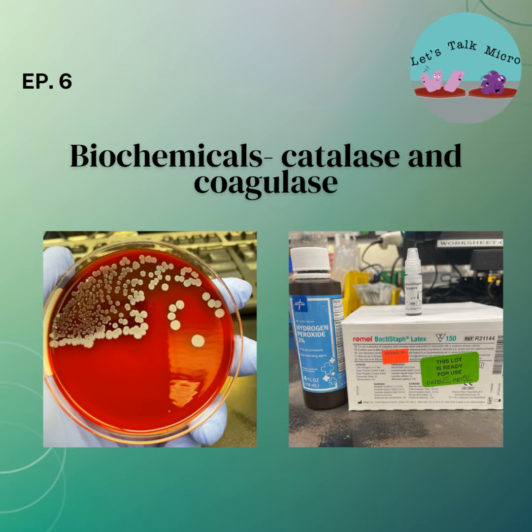And keep in mind that we don't use all the reactions for all the organisms. That would be wasteful, not only as far as wasting actual supplies, but there are some biochemicals that you don't need to do for certain organisms. If you perform them, you have to document them, and your patient might be billed for something that was unnecessary. So the patient might get charged more, and you're wasting lab supplies. So it is good to correlate those biochemicals to the specific organisms.